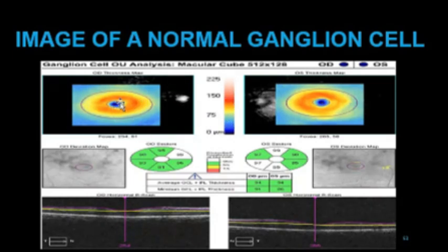Now you will also notice that the center here is blue, and a bit of black. Did you notice it? Yes. It is normal for every patient. I want you to find out why it is normal. So one of your take-home assignments: why is it normal here? There's a reason why this place is blue and black and it's still normal. Meanwhile, we are saying that when we are seeing blue here, it is wrong, something is going on. But why is this place blue and black and it's normal? I want you to find out and give me feedback.